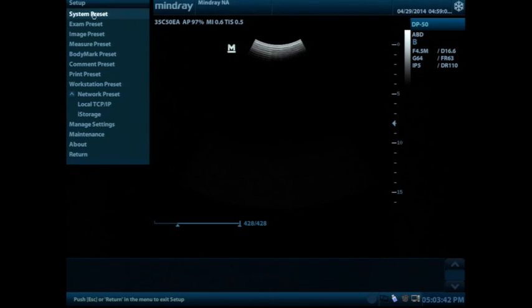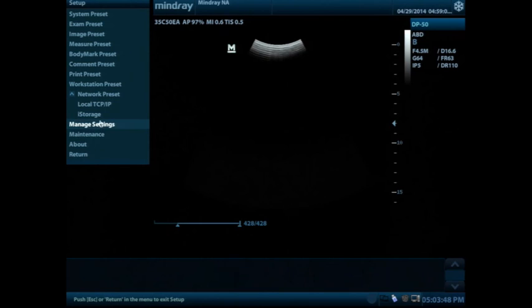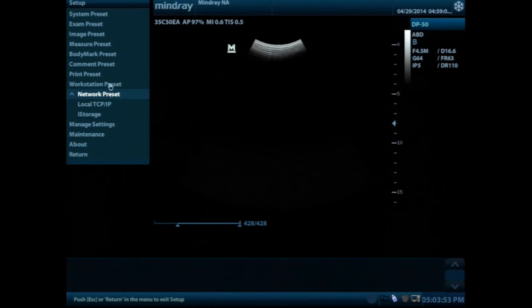Other things that you may do on this setup button, you can explore through here. You're not going to hurt anything and that's one of the things that you just want to look at and kind of get to know with your machine. Again referring to the manual as you go through.